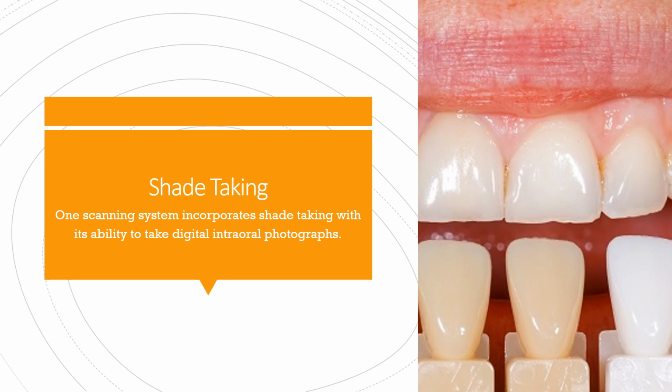Shades. There is one scanning device that incorporates shade matching. It takes the shade of the adjacent teeth during the scan of the prepped tooth, and it eliminates the potential for human error.